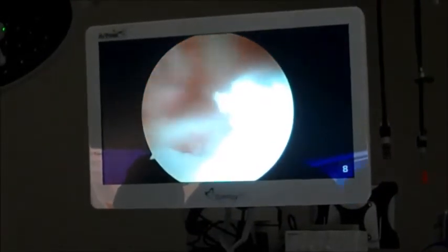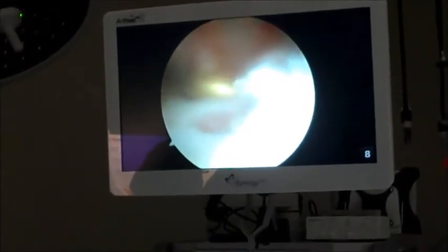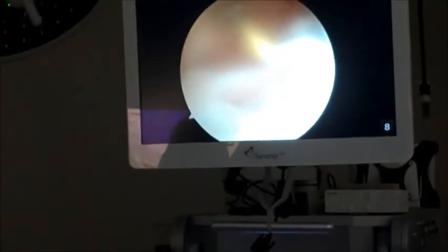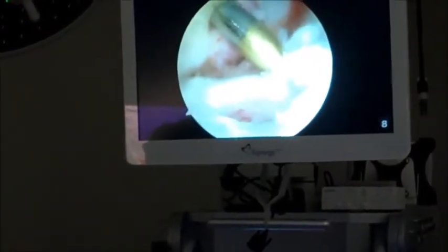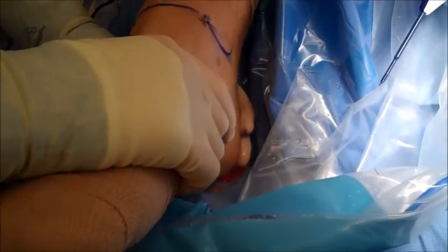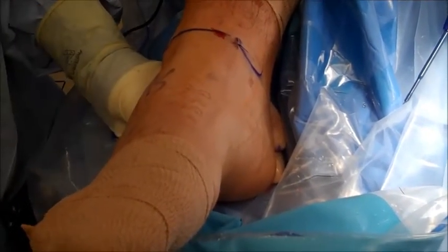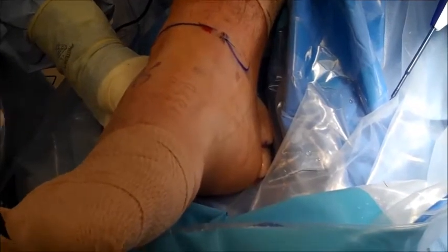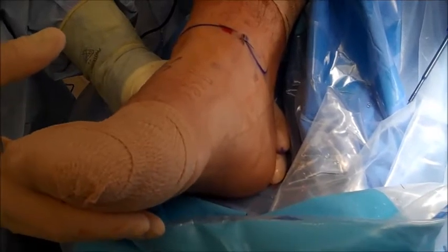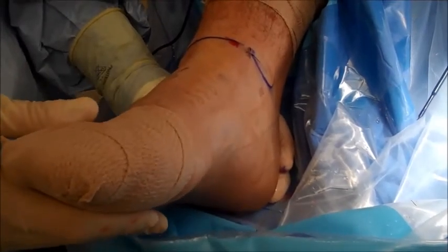You can see the bleeding in there from making that hole. So we've completed the procedure — we removed the distractor that opened the joint for us to get access. We've sewn the two portals closed with just one stitch each. This patient will go on a bandage that'll stay on until his follow-up, sutures removed at about two weeks, and he'll wear a boot for that period as well. After about two weeks he'll start physical therapy to get his motion back and reduce any scar tissue formation. At about eight weeks he'll be able to return to full normal activity.